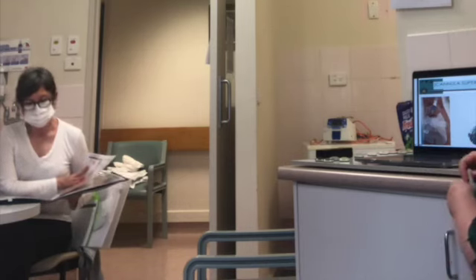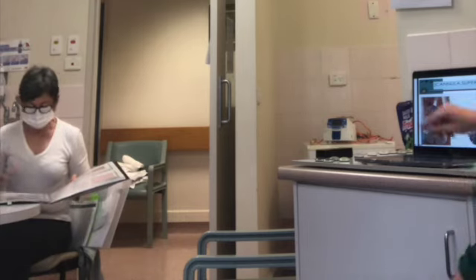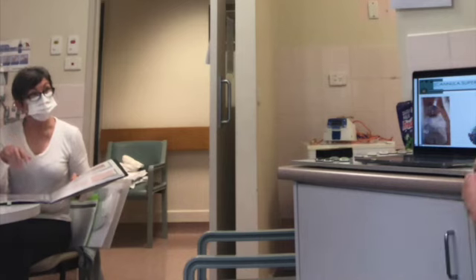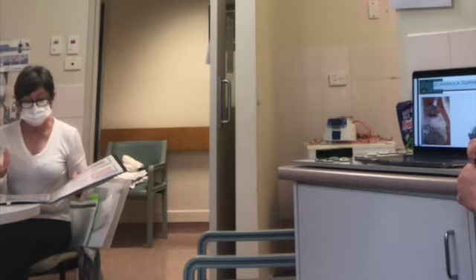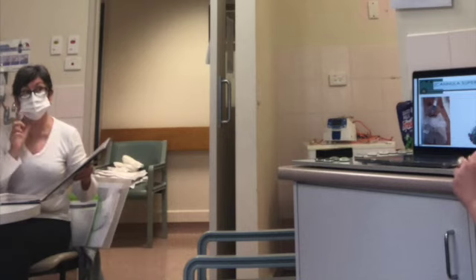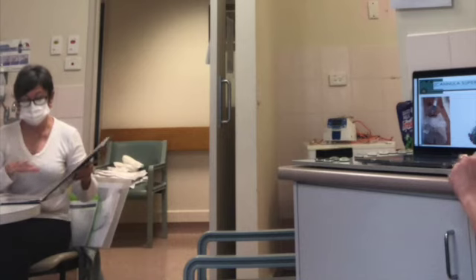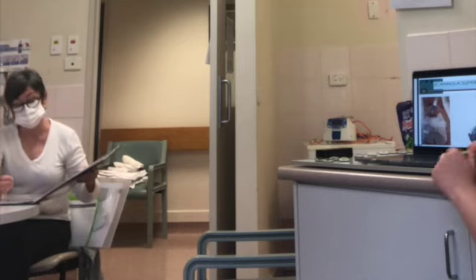Do you guys really use those extension ports? Tell me. A lot, because it saves you manipulating the cannula close to the insertion. That's how I was taught. For ward cannulation, you put on an extension tube because it stops you manipulating at almost the level where the cannula is inserted.